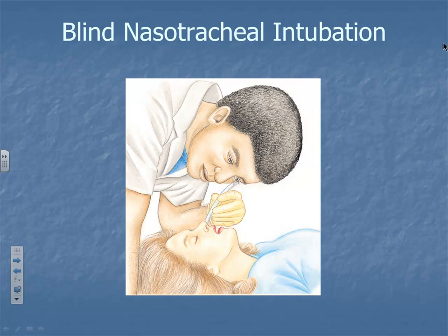As you're getting closer and closer to the glottic opening, that sound gets much stronger, so it guides you. And as I showed you early on, if you've got the ring tube, where did I put that thing? That's it. Remember I told you, if you think you're going to do a nasal, I've worked with partners that keep one rolled up in their pocket all the time. Is that nasty? Yeah, probably.